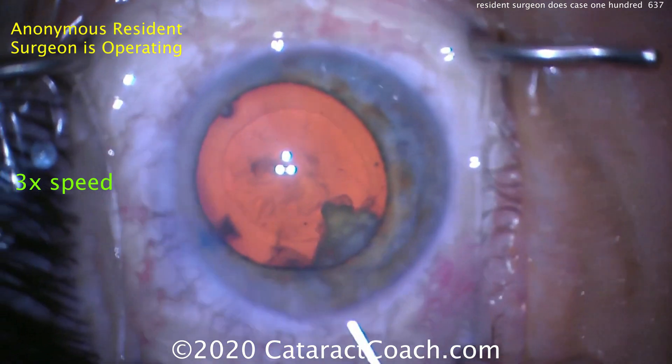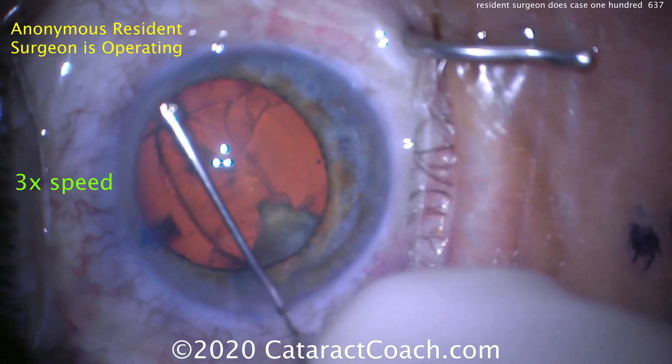Again, a lot of movement here from the patient. Maybe the patient would benefit from more systemic sedation.